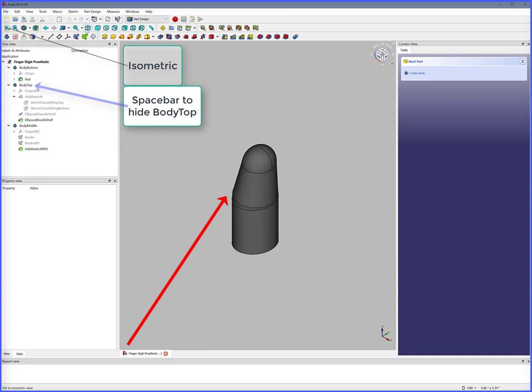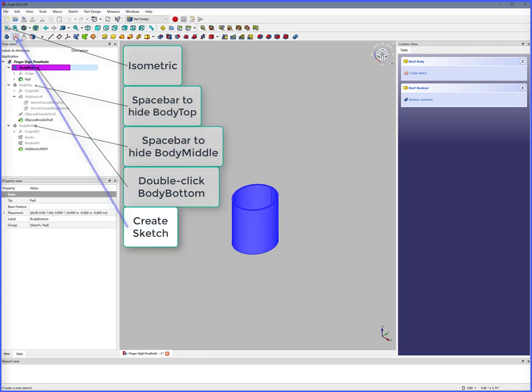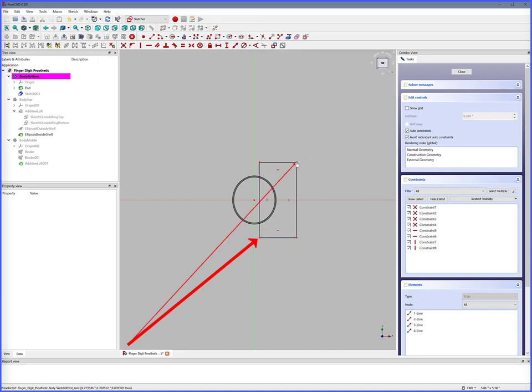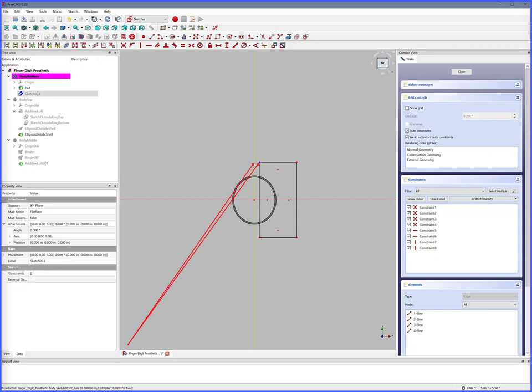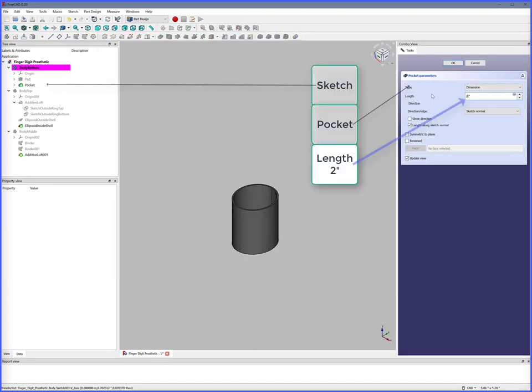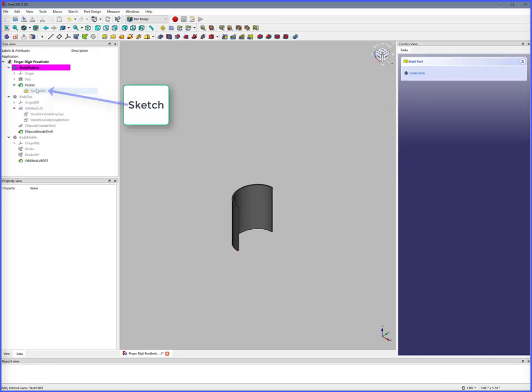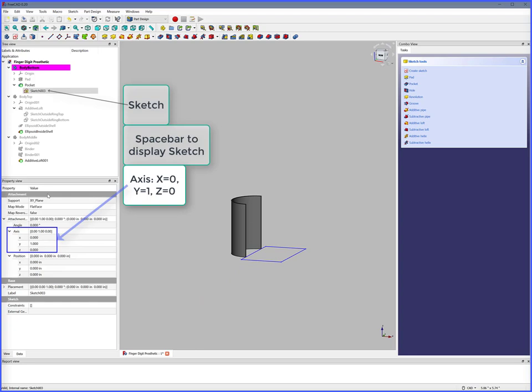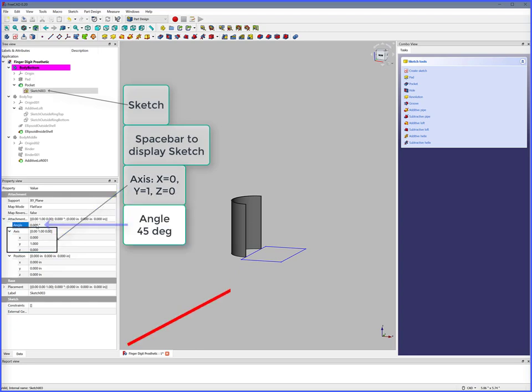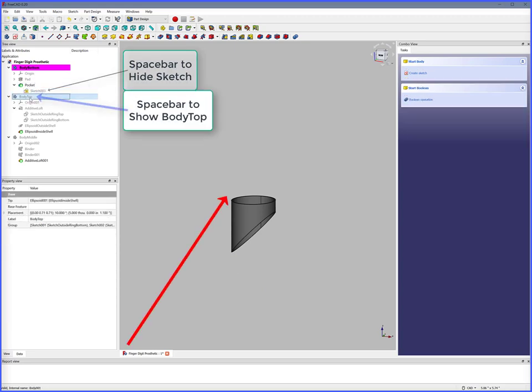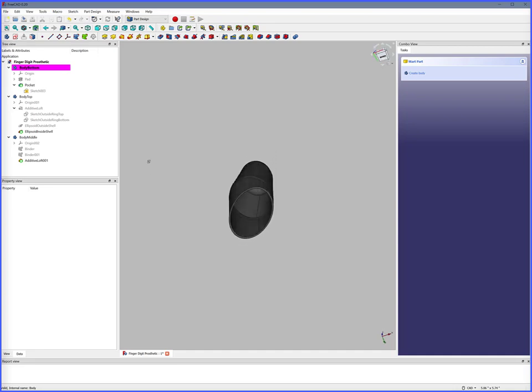Remove portion of the cylinder body. Isometric. Spacebar to hide Body Top, hide Body Middle. Double click Body Bottom, Create Sketch, XY Plane, OK. Create rectangle, click, double click to complete, right click to release. Select rectangle corner, select Y axis, Constrain Point Onto Object. Close. Select sketch, Pocket, Length equals 2 inches, Reversed, OK. Select sketch, spacebar to display sketch. X equals 0, Y equals 1, Z equals 0, 45 degrees, X equals minus 0.4. Spacebar to hide sketch. Show Body Top and Body Middle. A part of the cylinder body has been removed.